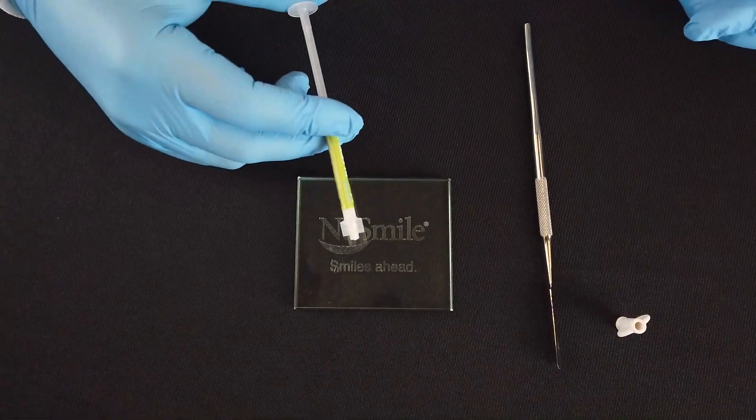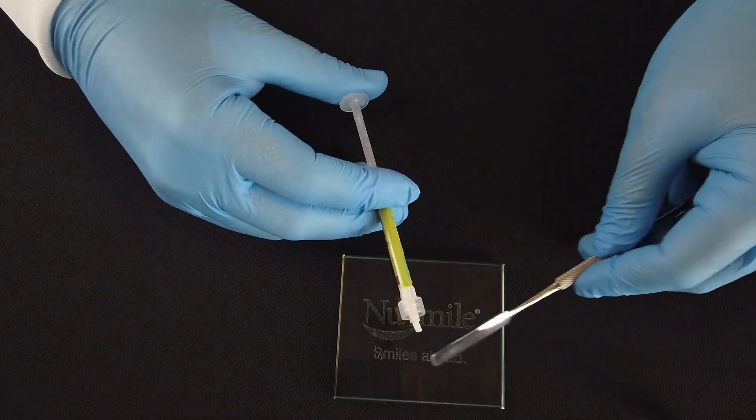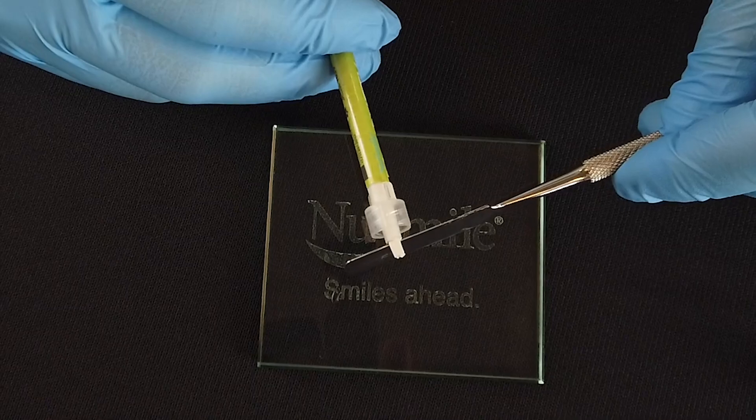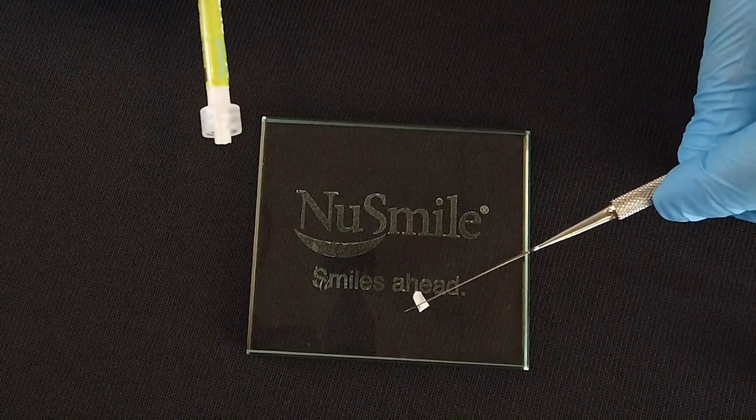Apply gentle pulsing pressure until the desired amount is dispensed. With your desired instrument, remove the putty and place onto a glass slab or directly into the treatment area.